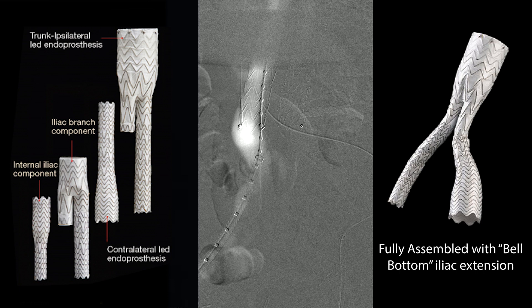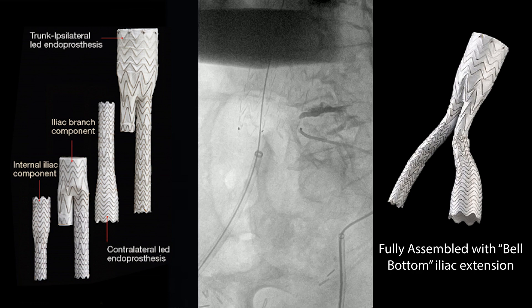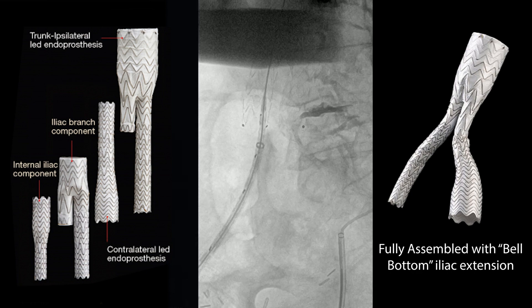The patient had an elevated creatinine, so we're actually using CO2 here, although it's kind of difficult to be absolutely sure. All you really need to know is where the hypogastric is coming off, so you have a little bit of dye. The plan is: number one, is there enough room to put on the bell-bottom — this contralateral leg endoprosthesis that's shown with the yellow arrow.